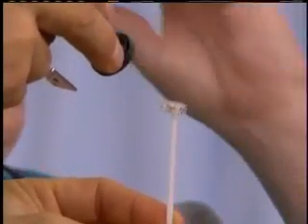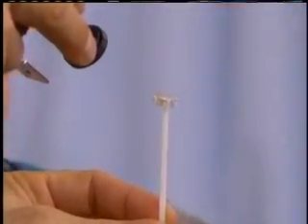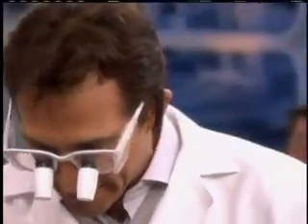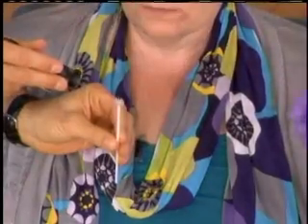These little bristles will rub up against these cells, pick up on the brush, and then the clinician puts that on the slide and sends it out to the laboratory. Can you all see that brush? Yeah. All right. Can you show how we would use it?